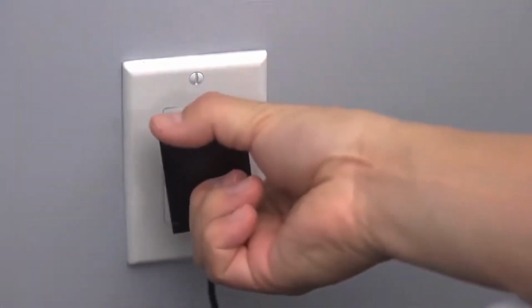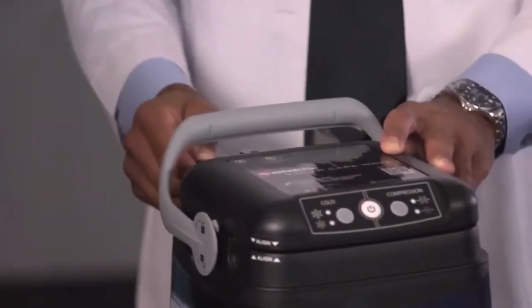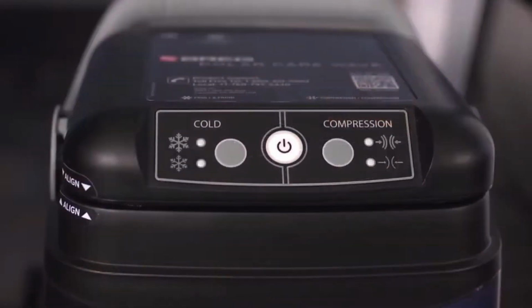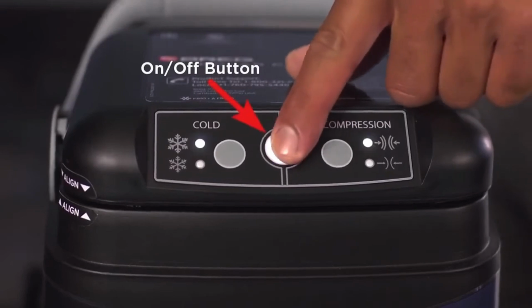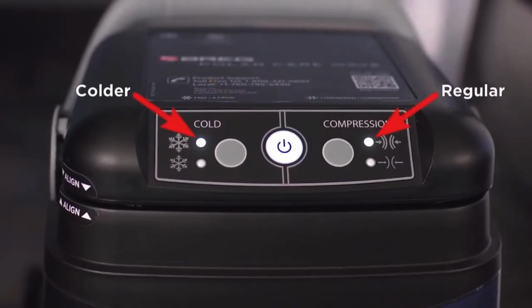Plug the power supply into the wall and the other end of the cord into the lid. The keypad lights on the front of the lid will flash quickly to show there is power. To operate the unit, press the on-off button to turn the unit on. The button will light up. The unit will start on the colder temperature and regular compression therapy settings.